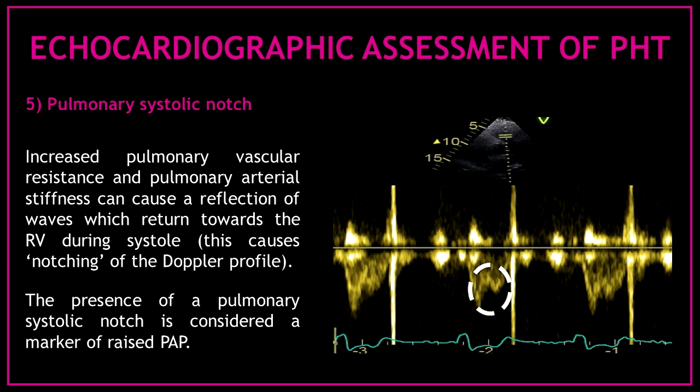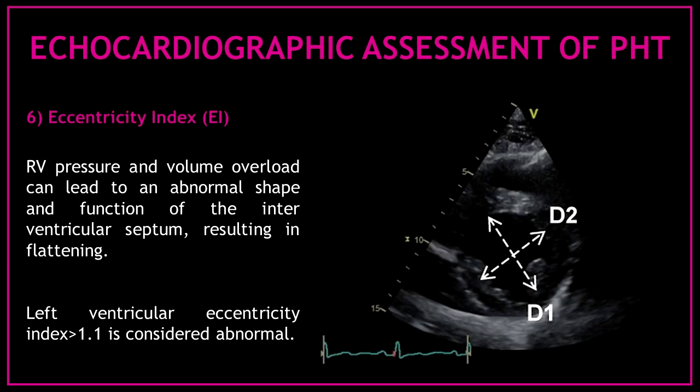Marker five is the visualization of the pulmonary systolic notch. Increased pulmonary vascular resistance and pulmonary arterial stiffness can cause a reflection wave which returns towards the right ventricle during systole, causing notching of the Doppler profile. The presence of a pulmonary systolic notch is considered a marker of raised pulmonary artery pressure. Marker six is the eccentricity index; right ventricular pressure and volume overload can lead to abnormal shape and function of the interventricular septum resulting in flattening. A left ventricular eccentricity index more than 1.1 is considered abnormal.